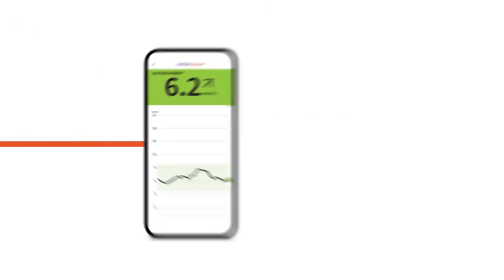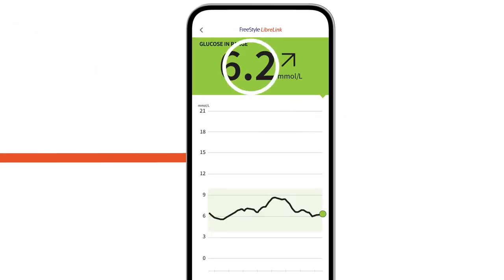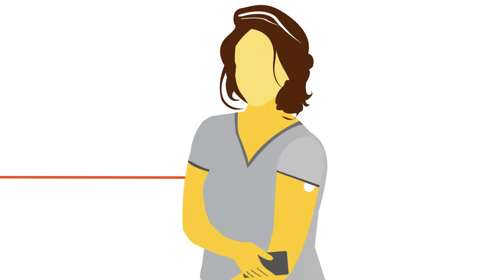That quick one-second scan shows you your current glucose, trend arrow, eight-hour graph, and glucose message. You can see where you've been, where you are, and where you're going — all this just by holding your phone against the sensor.